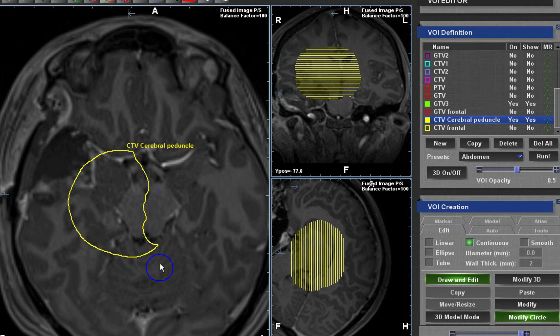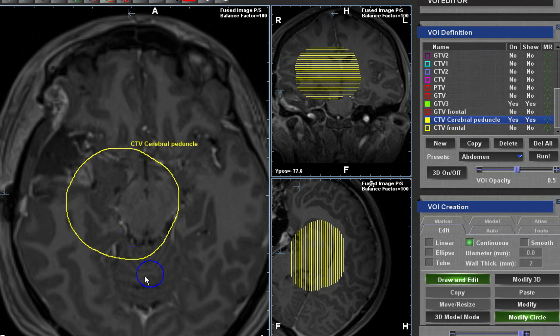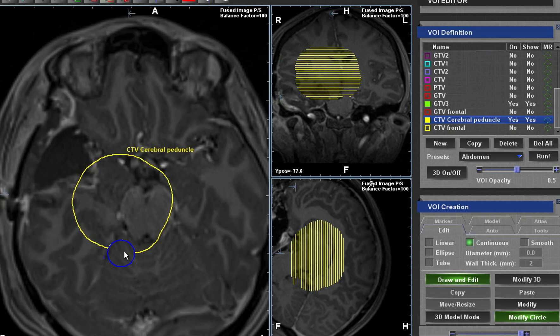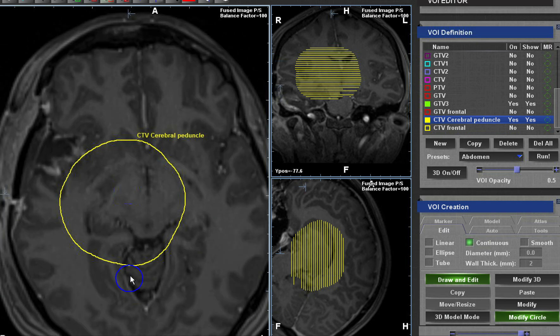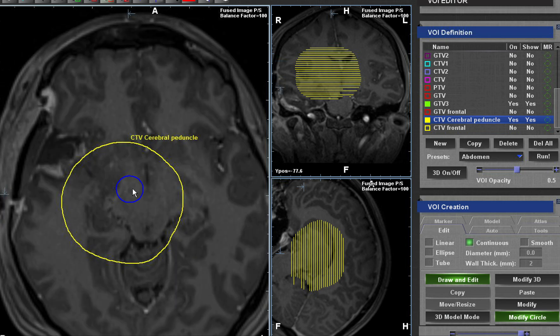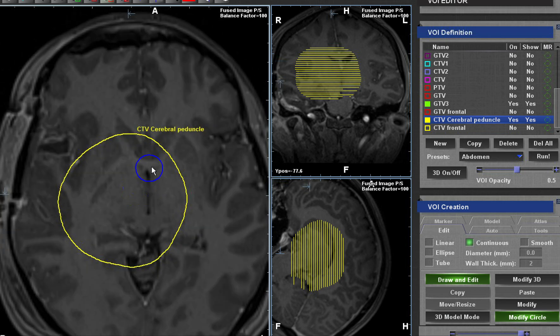As we all know, we trim at the level of the tentorium cerebelli. The best way to identify your tentorium cerebelli is to look at the sagittal view, so you can exclude it from your CTV. Another important structure to be aware of is at the third ventricle.